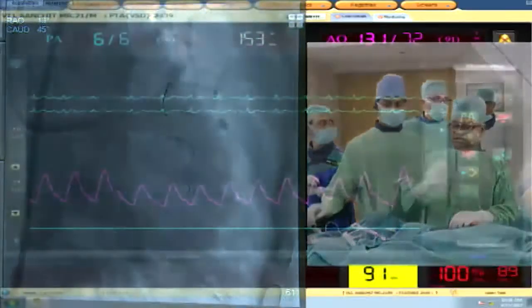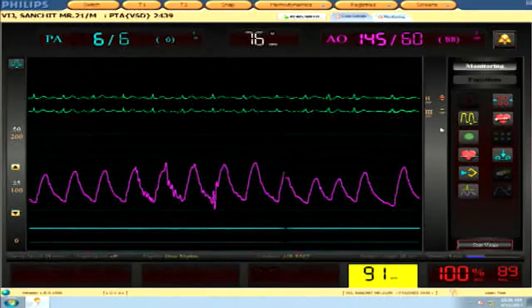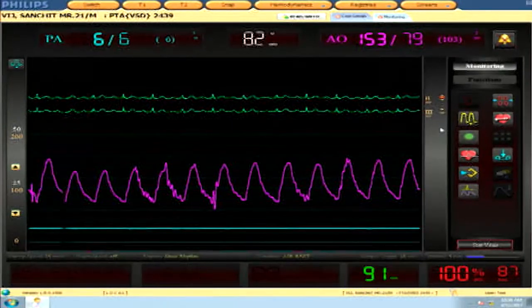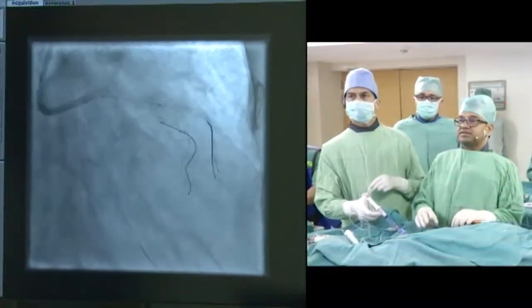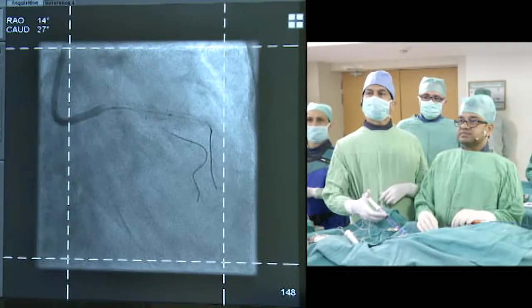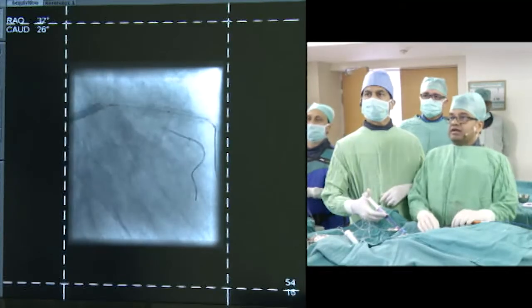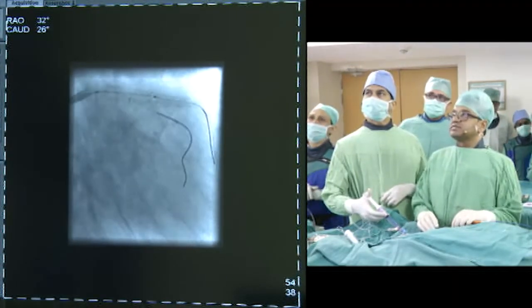Can you come to RAO and give a stent boost? We'll show a stent boost. How does it look? Whether we can appreciate in the previous stent the metallic stent and the platinum markers of this. There are too many dots to confuse all of us, isn't it?